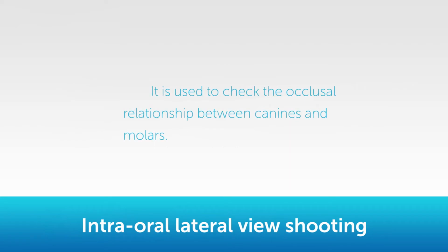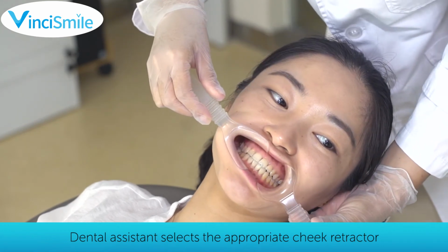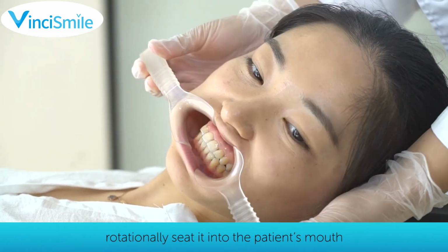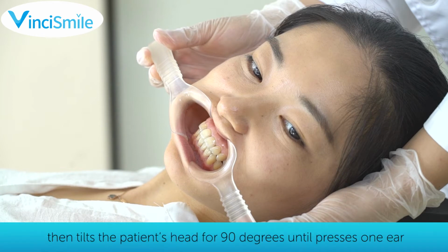Intra-oral lateral view shooting. It is used to check the occlusal relationship between canines and molars. Dental assistant selects the appropriate cheek retractor, rotationally seated into the patient's mouth, and pulls the retractor toward the respective ear, then tilts the patient's head for 90 degrees until it presses one ear.